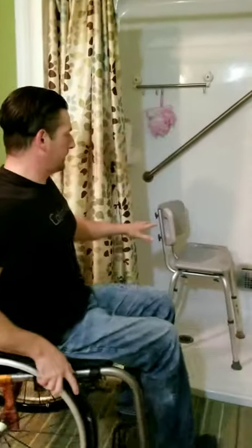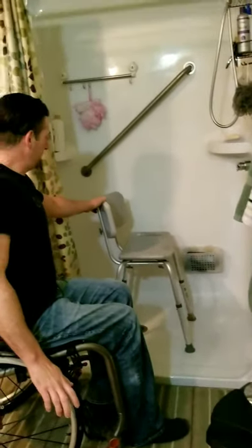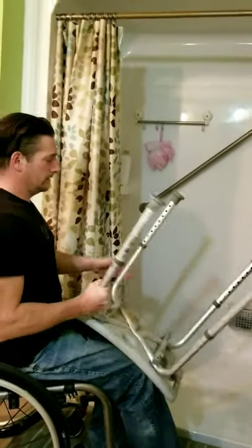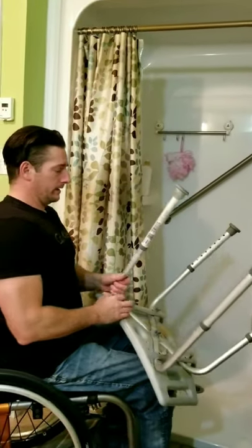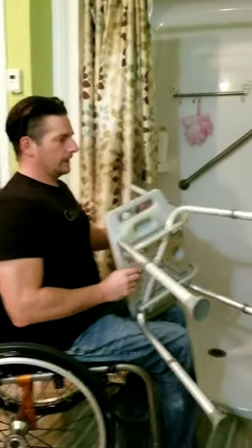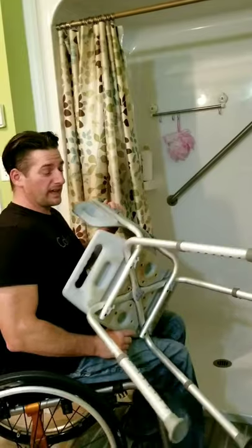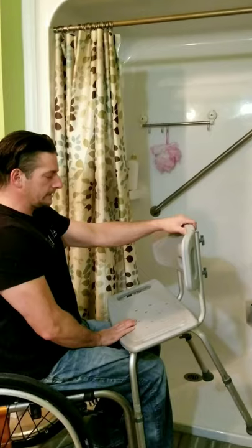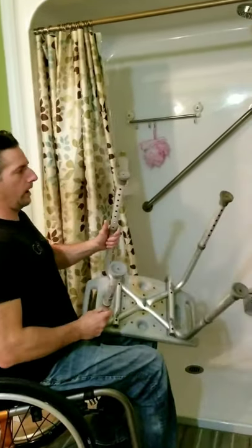I want to show you a little bit about this bath bench before I sign off. This is your standard bath bench — I got it at our local medical equipment supplier. You can also get these at Walmart, Shoppers Drug Mart, any place like that. They cost about 60 bucks. This one is probably five years old.